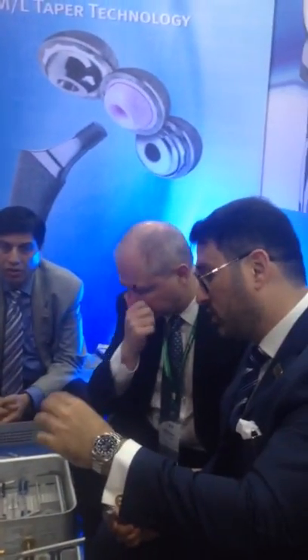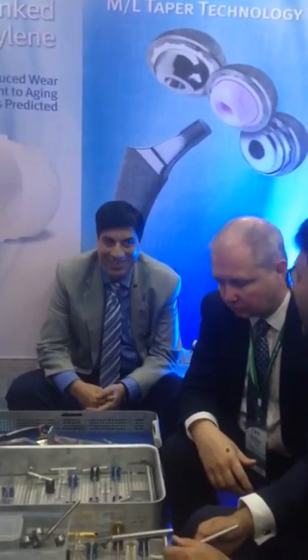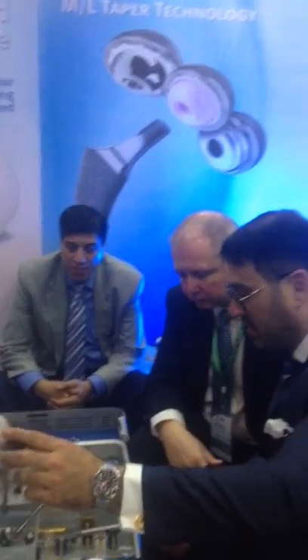We have the flexibility — not only this but also this. I don't know how much evidence that's supposed to work. And that shows the glenoids.